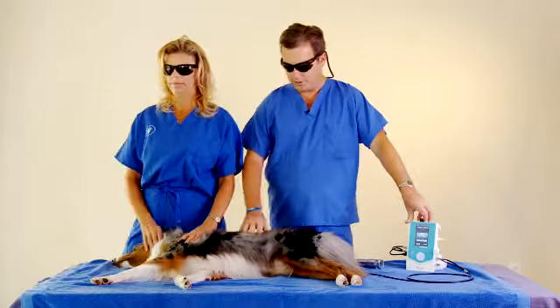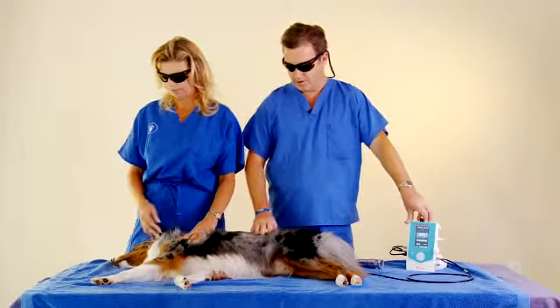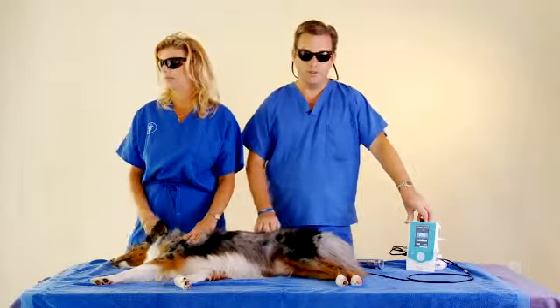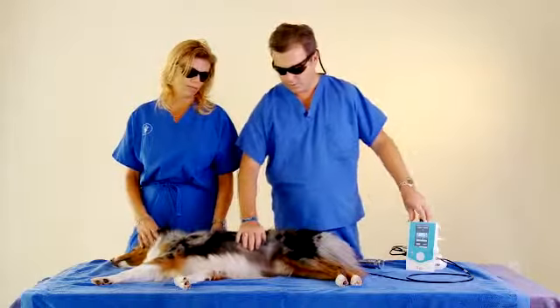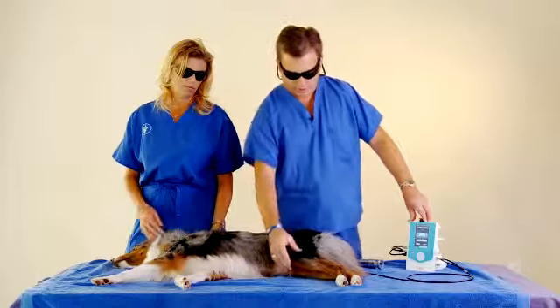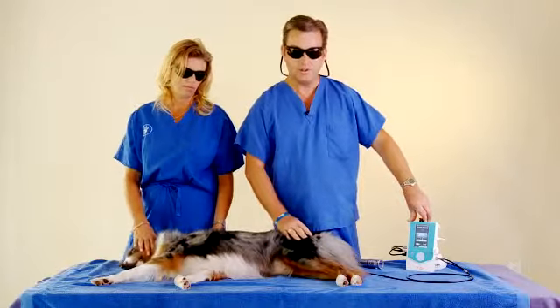You want a well hydrated patient, you want good nutrition with the animal, you want the right rest and exercise for the condition to stimulate the cells to regenerate. The other thing that you need to consider is the tissue that you're going through. If you're working on soft tissue, edema, congestion that has more water, you're going to go down about 2.5 inches. If you're going through solid bone, like a fetlock on a horse, it's going to go down about 2 inches.